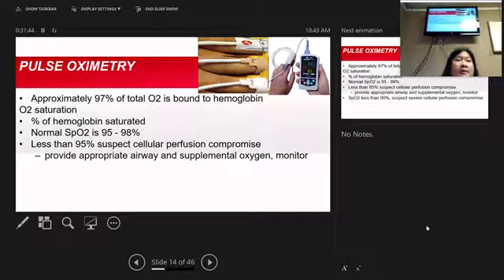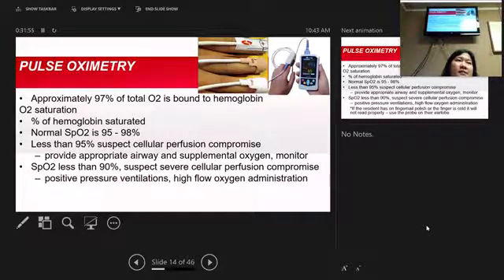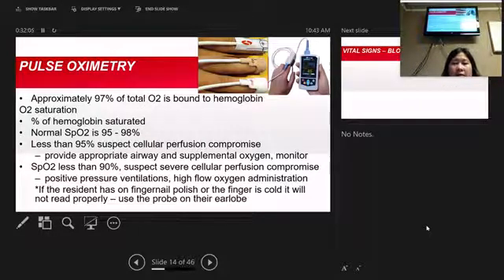They either need to sit up straight and deep breathe and cough, or they need to have some supplemental oxygen put on once we get below 90. But usually if you're taking it and you first get it and it says 80, tell your person to sit up, take a deep breath, cough some, use their incentive spirometer machine to open up their lungs to get their oxygen saturation higher.